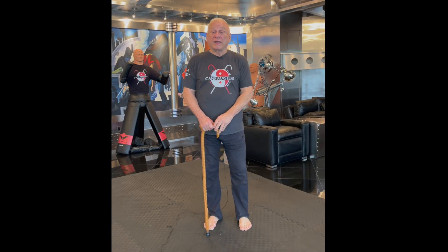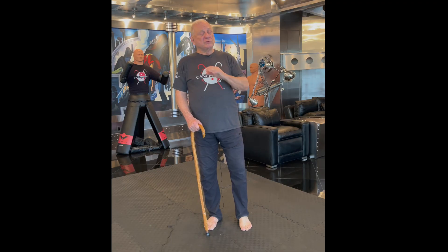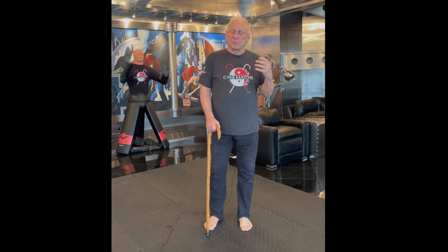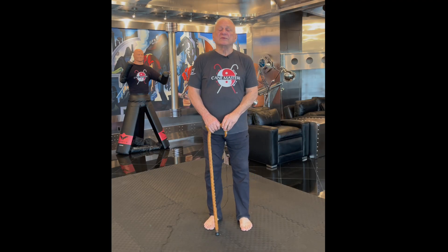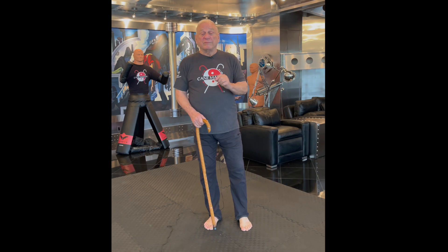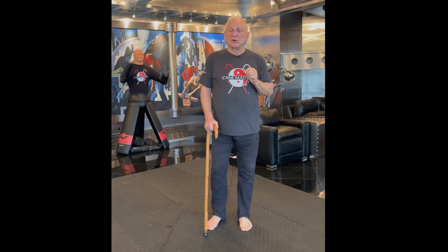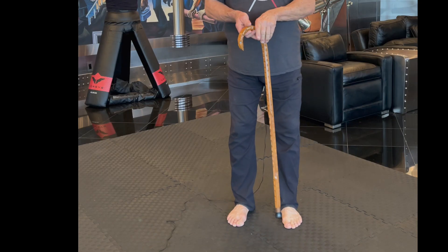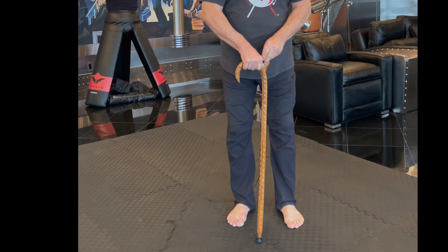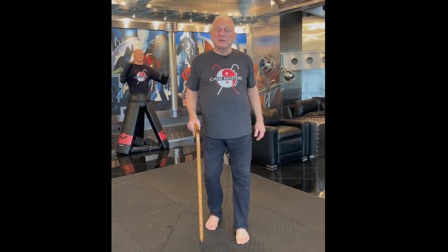Now, if you have received medical advice or you're working with a trained therapist, you should always follow what they tell you in the way to carry a cane. However, in our many years of experience and thousands and thousands of customers, we've observed that most people carry a cane incorrectly. What you see most people carry is a cane with a horn to the rear, and this is the common thing that you see.